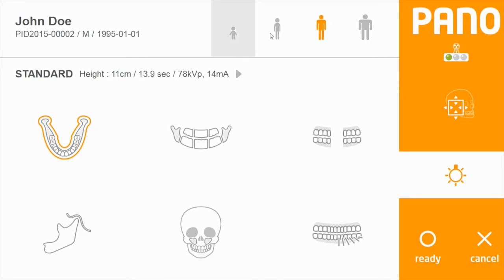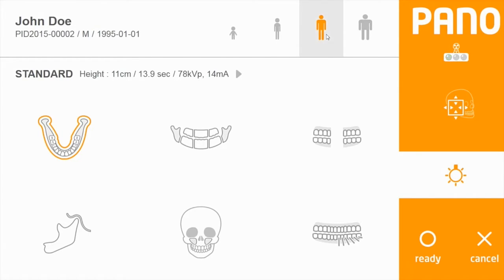In this interface, the patient type options range from child to small, medium, or large adult. The default is medium adult.